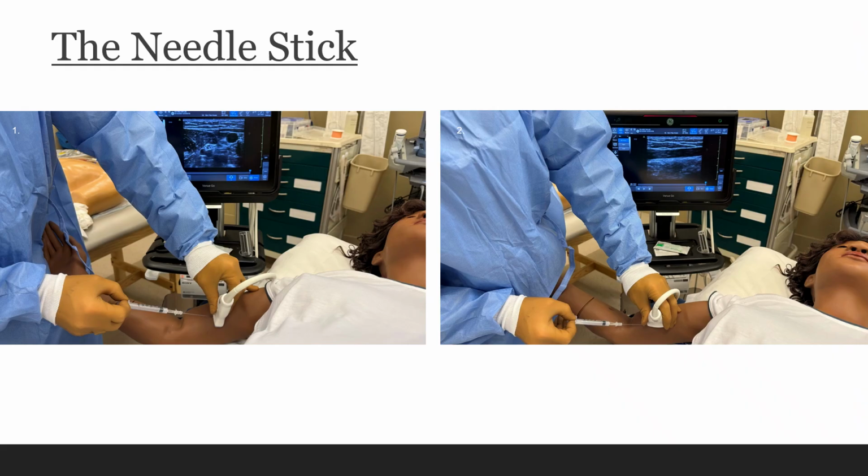So now we've got everything set up, ready to go. Let's start the actual meat and potatoes of the procedure, if you will. So just a little asterisk here, when we were taking these photos for this talk, I wanted you to be able to see where the patient is positioned and where the operator should be positioned. So typically you'd have your fenestrated drape. I'm usually a little bit further down, but it depends on the patient's anatomy and what vessel I'm aiming for, kind of draped over. And then you have your opening within that broader area, so you have plenty of room to work around with your ultrasound probe.